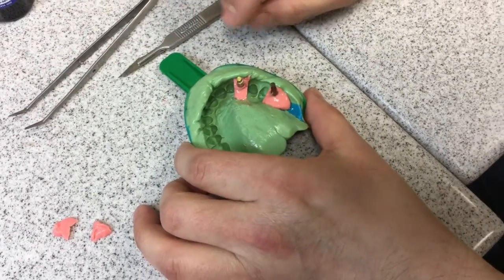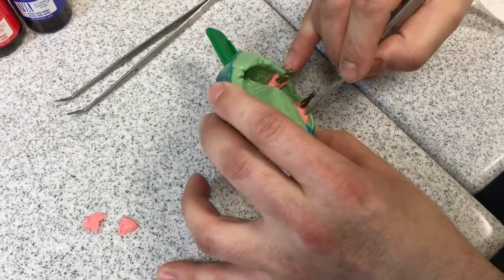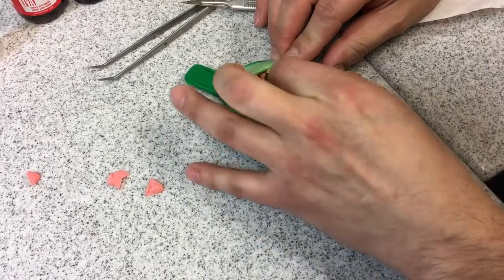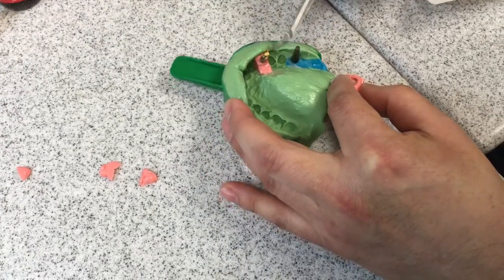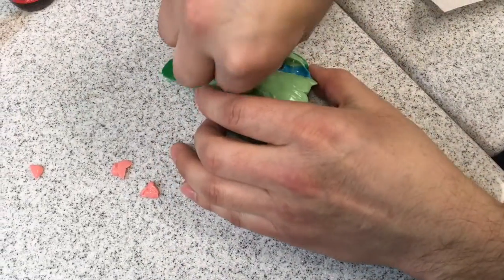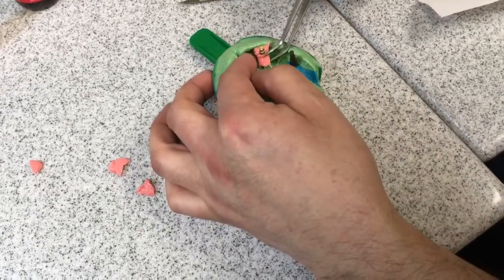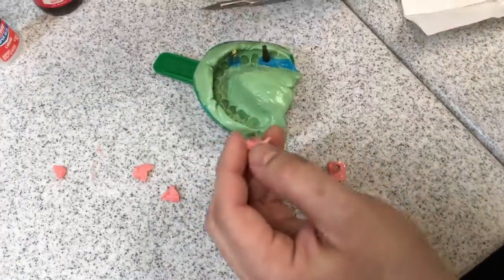Now we're gonna pull this, and might as well clean this corner up too. We're pulling this because even though we put separator on, the materials sometimes want to stick together anyway. You can see that film of material separating — if it's on there it's okay, it's not gonna hurt anything. Now if we had trimmed this back it would be easier to remove, so maybe we still want to get into the habit of removing it, unless you're making an RPD or denture and don't need all that information.